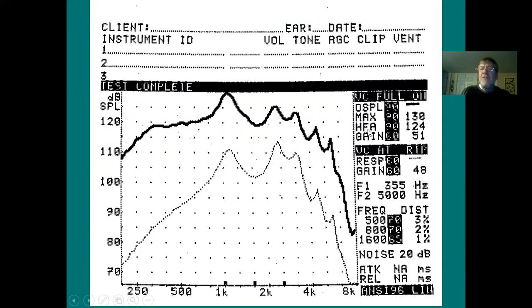And then the high frequency average, that's going to be the maximum power output at 1,000. Look to the bottom of the screen now. See the 1K, the little square? And then over here, just below 2K, that's 1,600. And over here, you'll see a third one, 2,500 hertz. High frequency average is always 1,000, 1,600, 2,500. Those three frequencies.